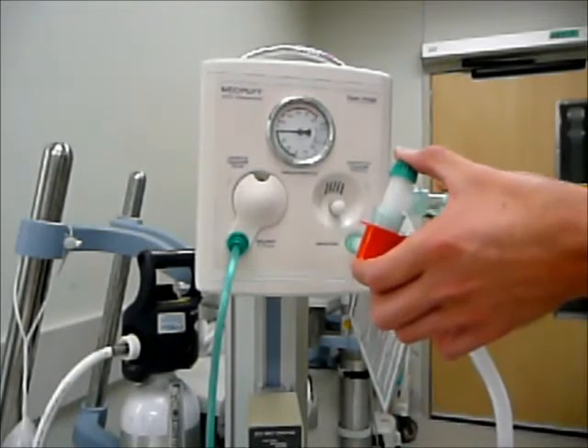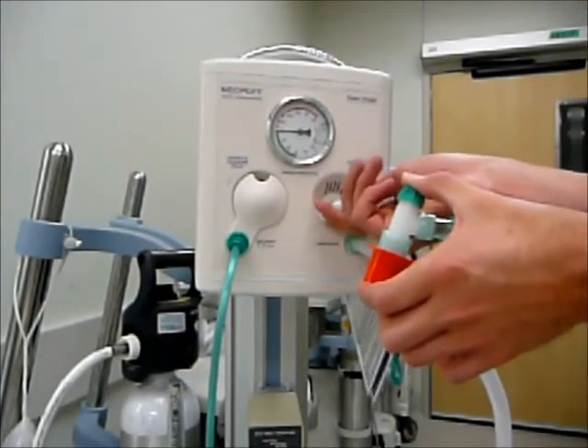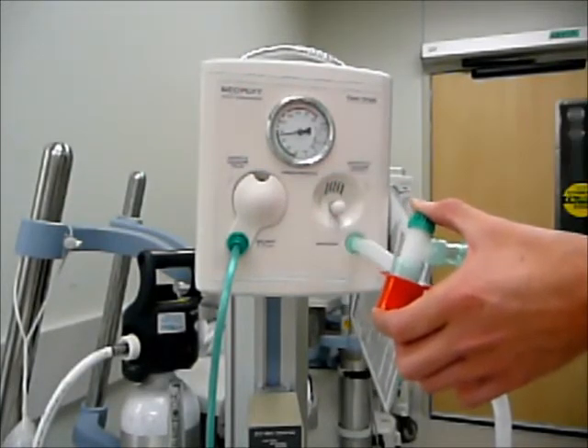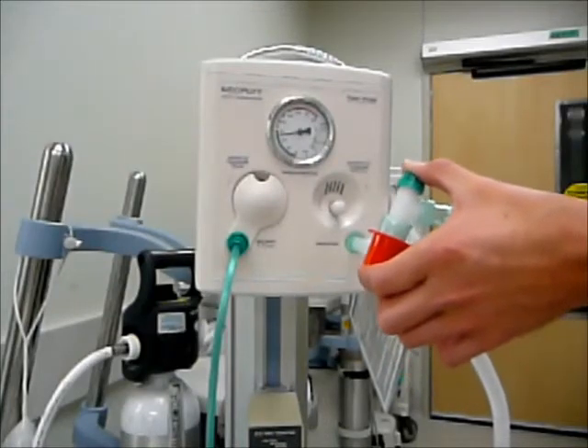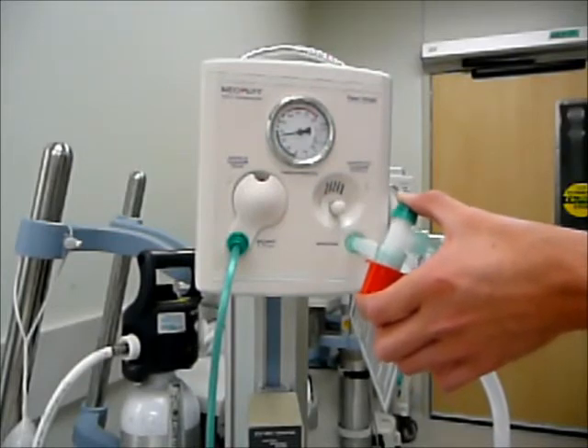Next, what we are going to want to do while still blocking both ends is adjust our peak inspiratory pressure. Peak inspiratory pressure is usually set at 25 to 30 centimeters of water for a term infant, and 20 to 25 for a preterm infant. Here we've got it set at 25 centimeters of water for a term infant.